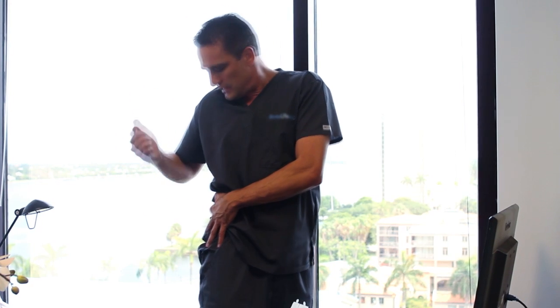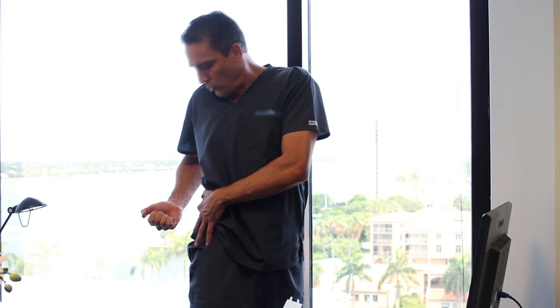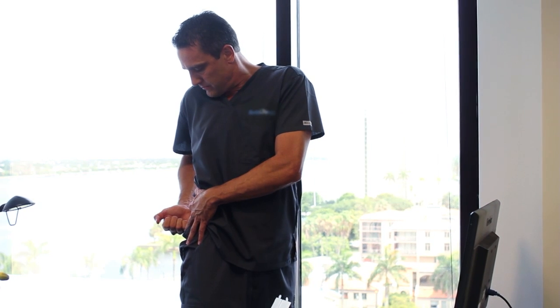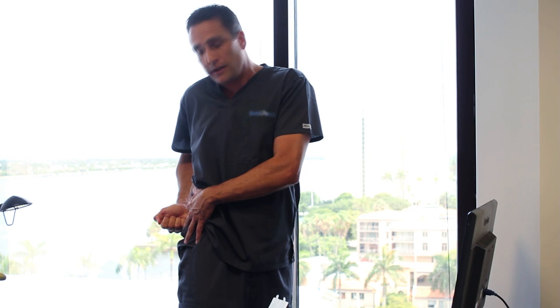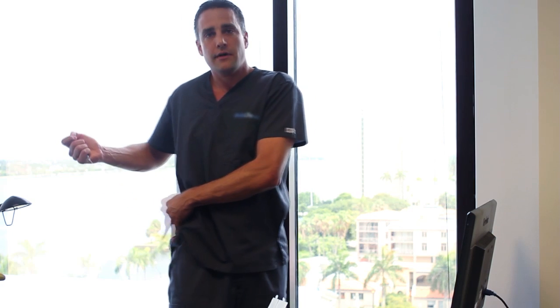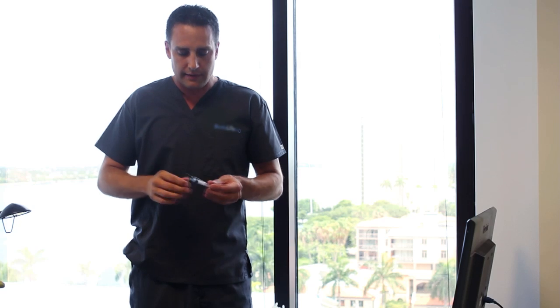Tight grip on the needle, upper outer quadrant of the area, and quick in, one shot. Push in the plunger, take your time. Done. Very simple, very painless, easy to do. Take your time and relax, and it's very easy to move forward.